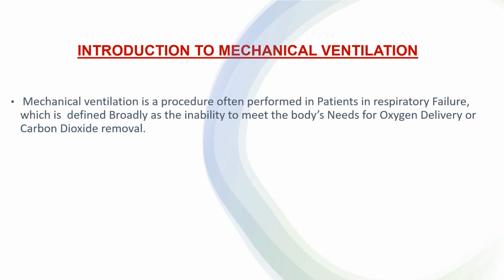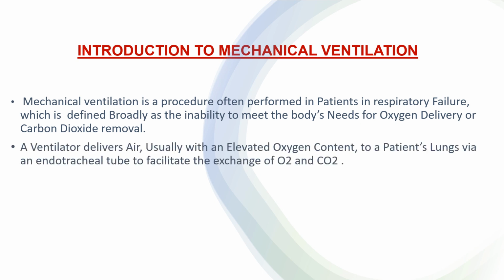Mechanical ventilation is a procedure often performed in patients in respiratory failure, which is defined broadly as the inability to meet the body's needs for oxygen delivery or carbon dioxide removal. A ventilator delivers air, usually with an elevated oxygen content, to a patient's lungs via an endotracheal tube to facilitate the exchange of O2 and CO2.